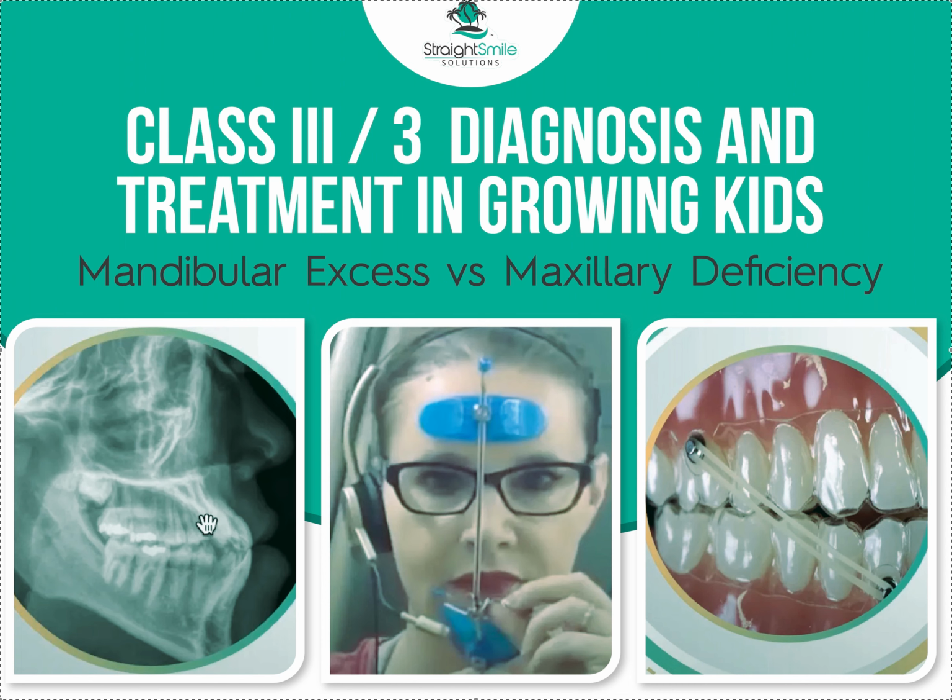Well, obviously the gold standard is going to be to get a cephalometric x-ray like this, and then have it run into one of these various online programs. And if you don't know how to do this, I have a ton of content on my website, Straightsmile Solutions, specifically the YouTube channel. You can go to the YouTube channel and put in the keyword CEPH, C-E-P-H, or you can just scroll down the homepage and there'll be a playlist all about CEPHs. You can use one of these various companies, very low cost, that will spit out a report, standard deviations, things like that, norms, and it'll tell you which one it is.